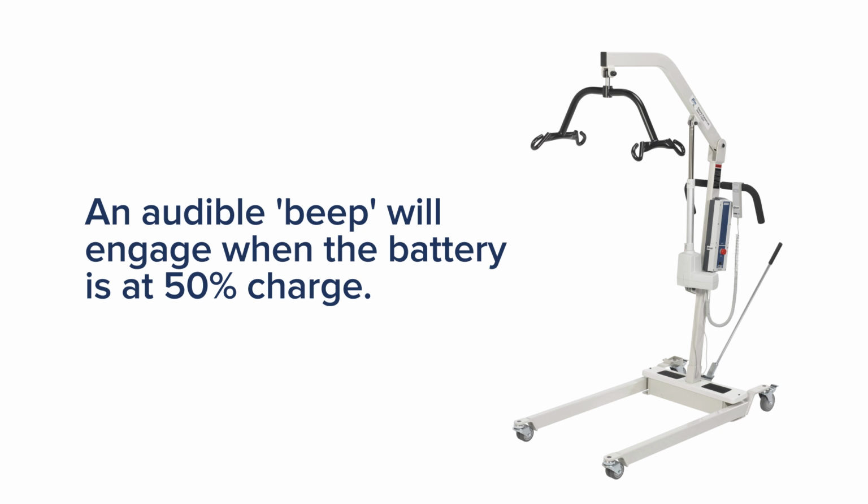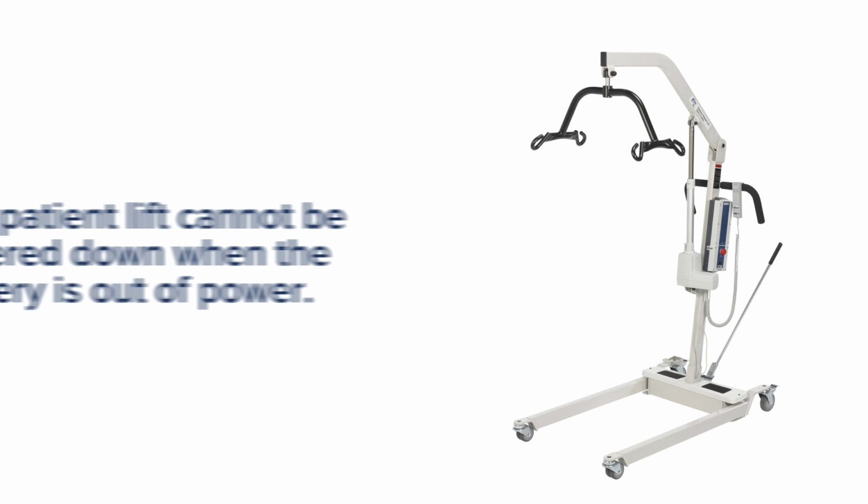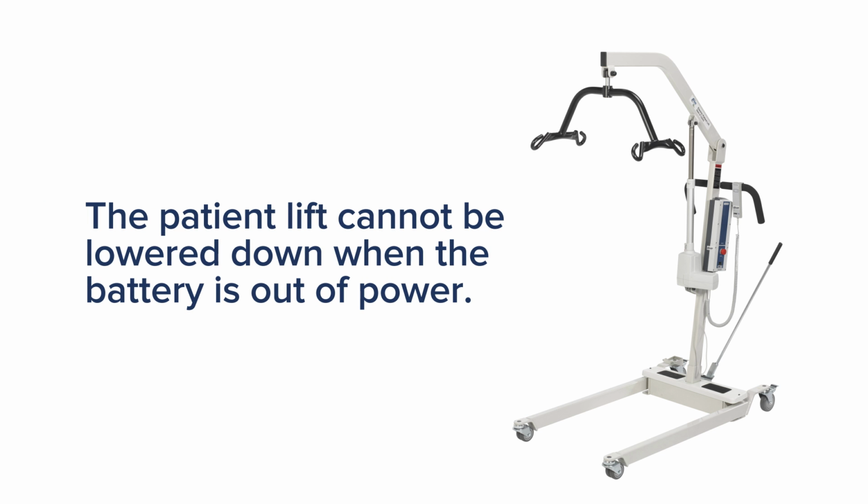When the battery power is below 50%, an audible beep will engage. When the warning is heard, charge the battery immediately. The patient lift cannot be lowered down when the battery is not properly charged.